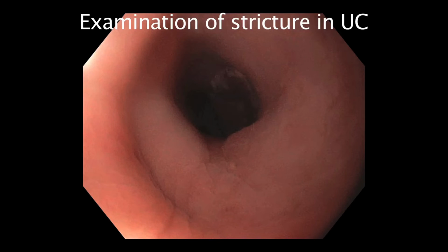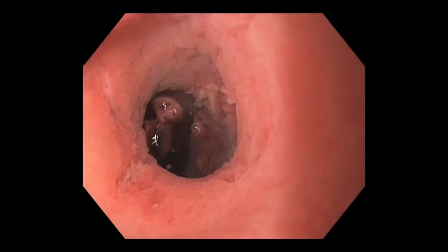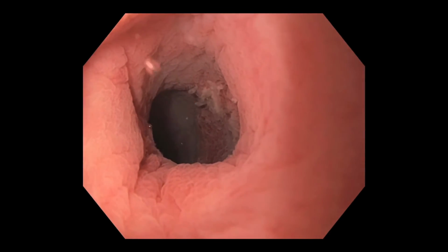Examination of strictures can be difficult as the luminal narrowing can restrict tip deflection, illumination, en-face assessment of mucosal detail, and targeted biopsies. In this video, we do not thoroughly discuss the examination of strictures. Nonetheless, the principles of detailed imaging are again shown in this case.